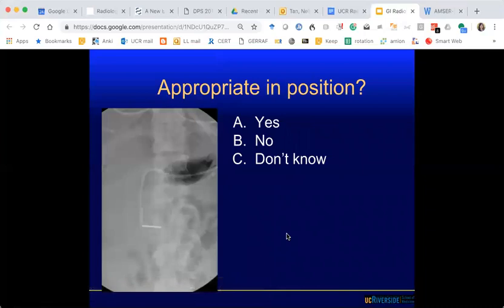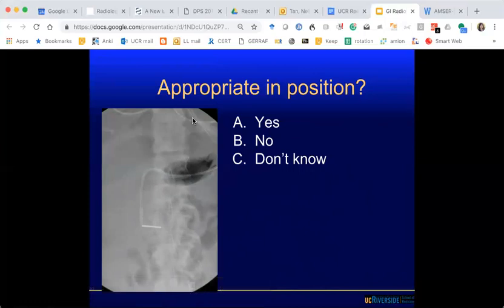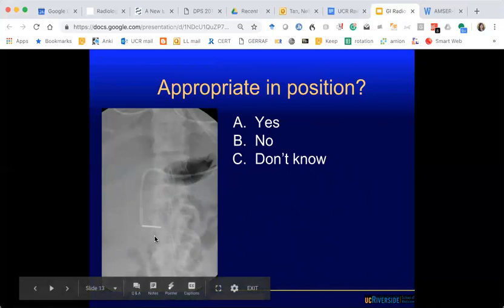Is this catheter or tube in proper position? What kind of tube is this — a feeding tube or an NG tube? We see two tubes here. One is there, and then the other one crosses over and goes south. What kind of tube is this? GJ? We'll review that.